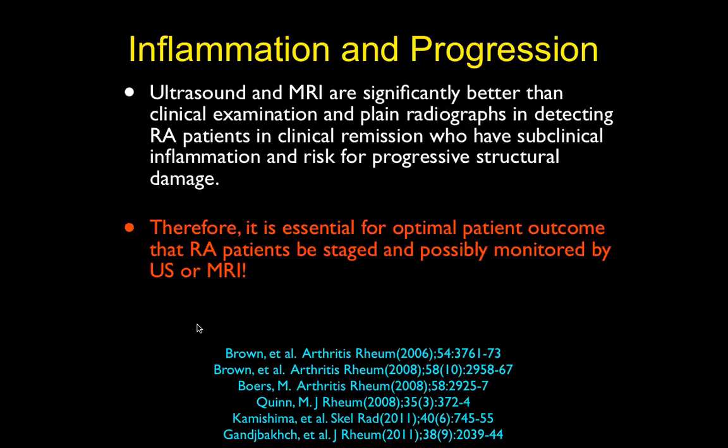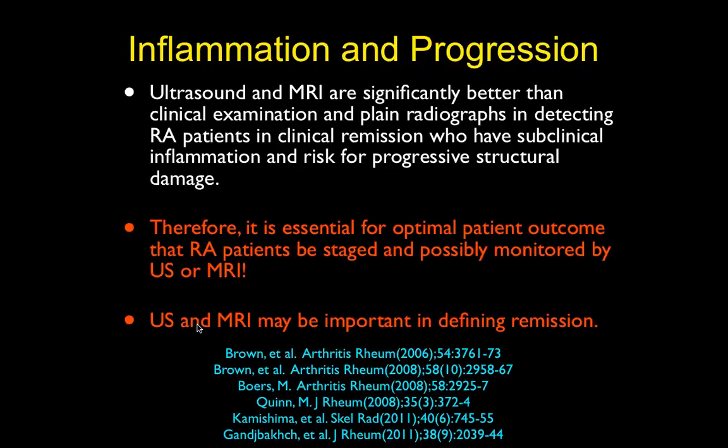I think MR is much better because ultrasound can't see the osteitis. It can only see erosions, and I think you want to pick it up before you develop the irreversible erosions. So I think MR is much more recommended. The thing is that ultrasound is much more available around the world. It's in the clinic, and therefore there are arguments why that is better than not doing anything, especially if you don't have MR available, and it's a lot cheaper. So in areas where cost is a big issue, then you might want to go with ultrasound, even though I think it's suboptimal. It's a big issue everywhere.